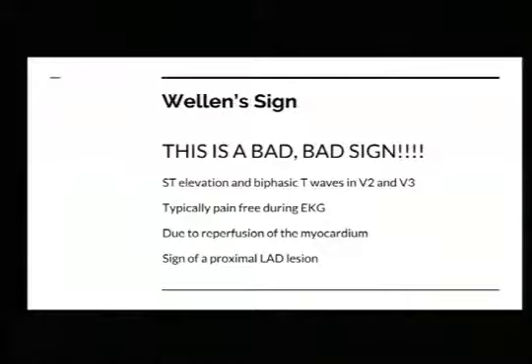But biphasic T waves in V2, V3, some mild ST elevation, they're often going to be pain-free because they had an event, and now we're seeing the reperfusion of the myocardium when you're getting them. So they don't have the pain anymore. Lactic acid's going away, pain-free, but they have a proximal LAD lesion.